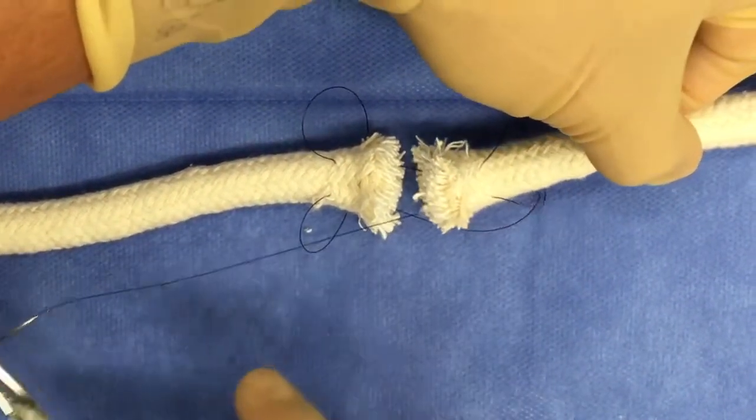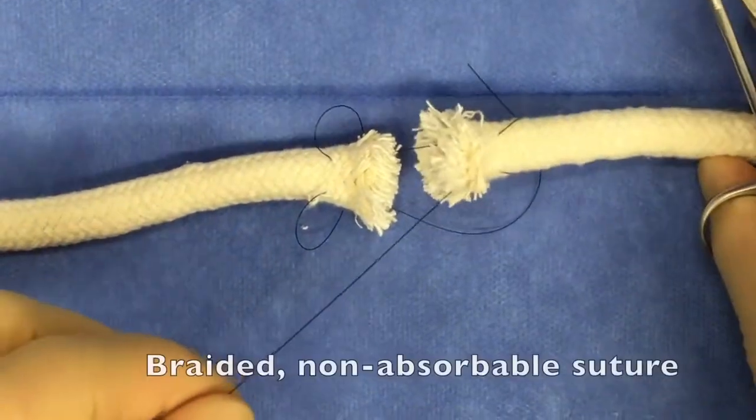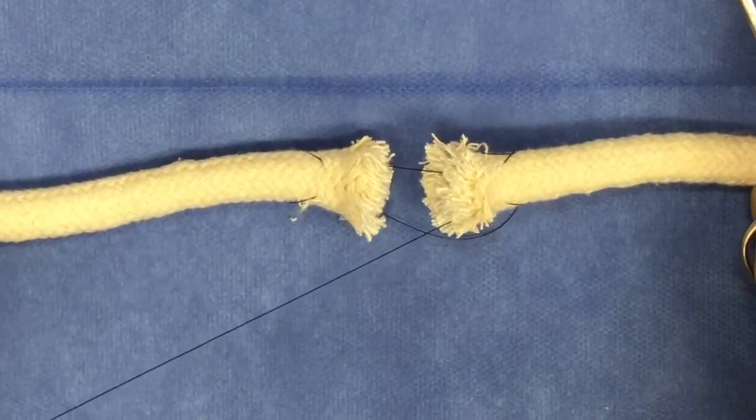Keep in mind when performing this technique, you're going to want to use a suture of sufficient strength. Typically, a braided, non-absorbable suture such as Ethibond is ideal for this type of repair.